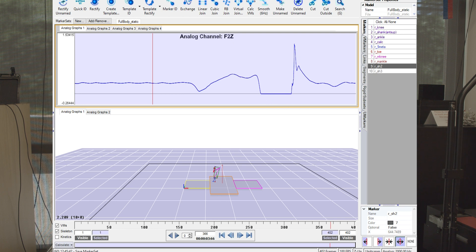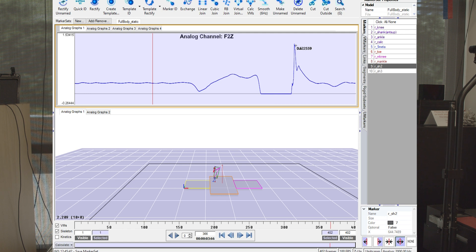And then here, when she's in flight phase, there's no forces. And then during the landing phase, we see peaks that are around four times body weight. So she's landing, she's absorbing a lot of force. That's oftentimes when injuries happen because everything is happening quickly and she's decelerating very quickly as she hits the ground.